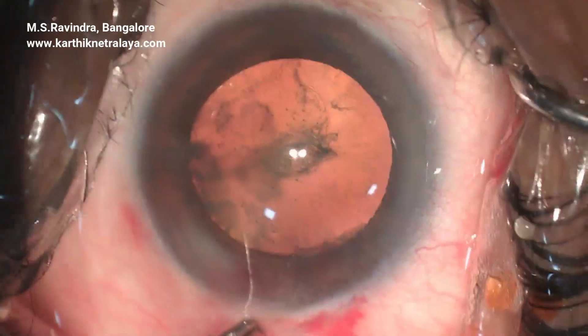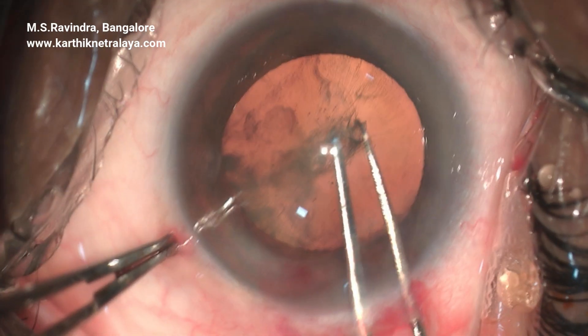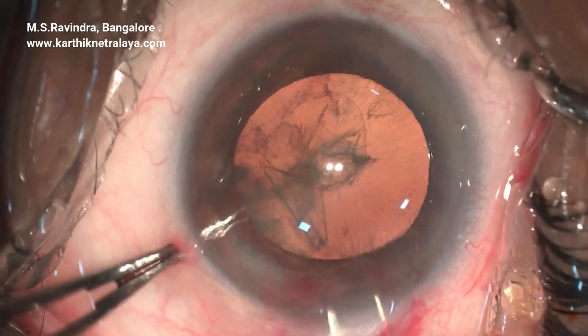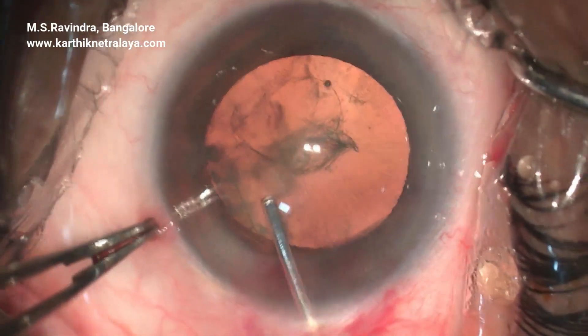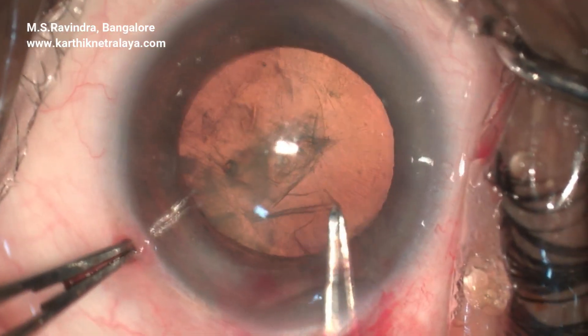An interesting case of long anterior zonules wherein the zonules continue up to the center of the lens and makes the rhexis more challenging. Continuous curvilinear capsulorhexis was not possible, so it is converted to multiple injections of viscoelastic and slow and steady completion of the rhexis.